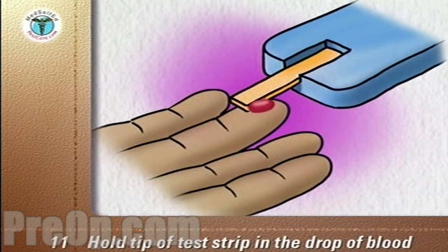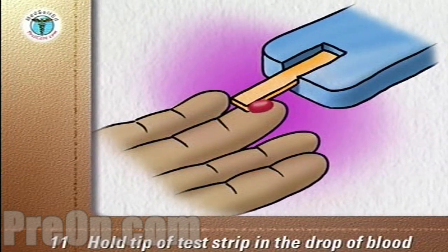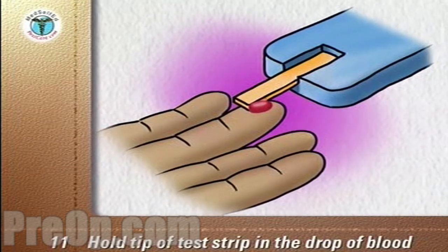Hold the tip of the test strip in the drop of blood until the meter tells you the test strip is filled, usually by beeping. Remove the test strip from the blood.